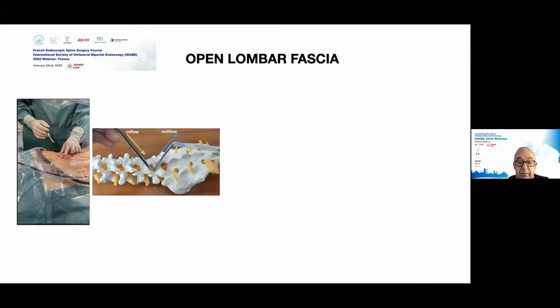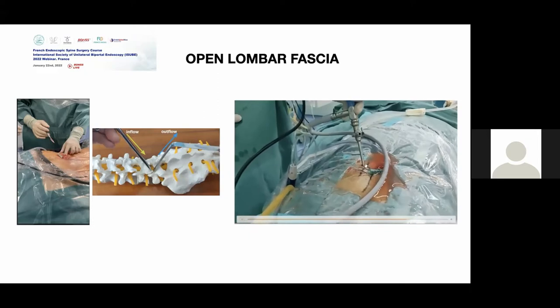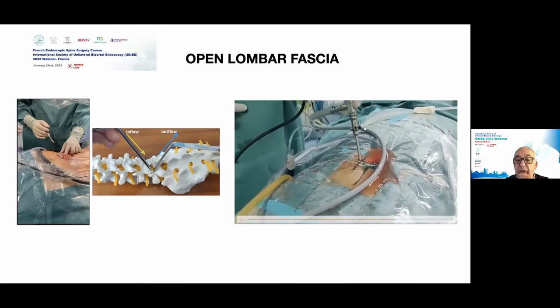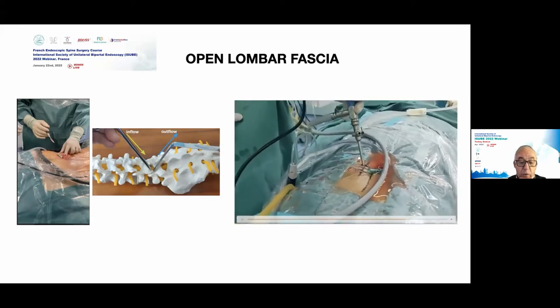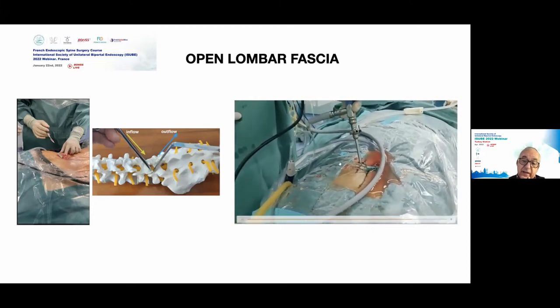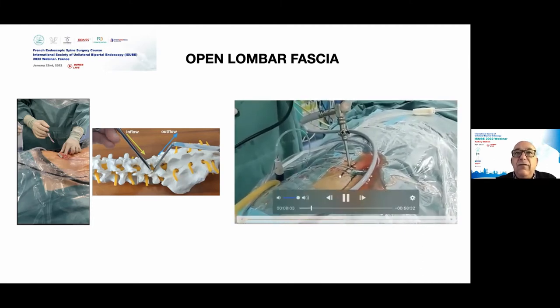First, the incision must be large enough to allow a large amount of saline solution to flow in and out. When we introduce the endoscope into the incision and open the saline solution, it's very, very important to see the solution coming out of the lower hole, like you can see in this video. It is also necessary to be careful that the endoscope working channel is not narrow and that it allows a good exit of liquid. In my first surgery, I had this problem: the endoscope channel did not have a good flow of saline solution and I couldn't see very well.